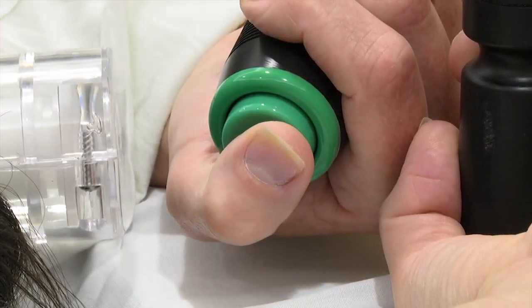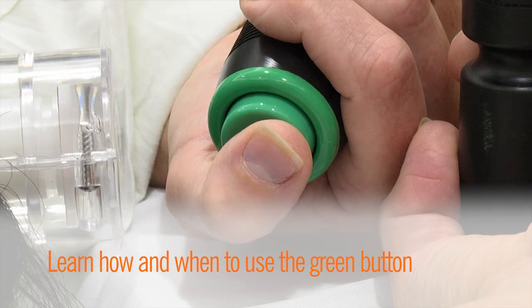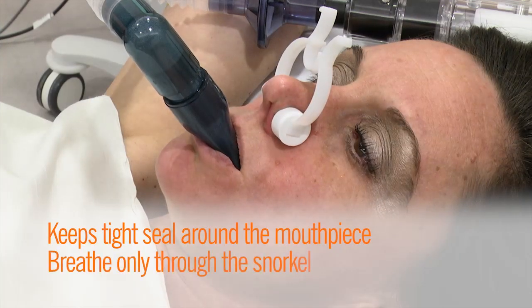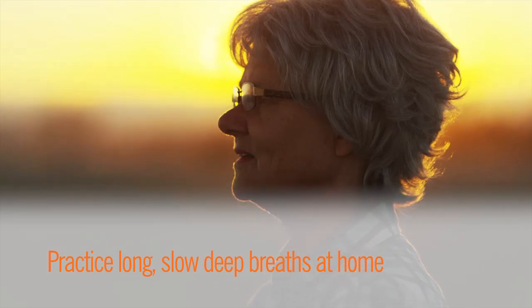Here are some important tips to remember. You will learn how and when to use the green button. Keep a tight seal around the mouthpiece and breathe only through the snorkel. You can practice taking long, slow, deep breaths at home before your treatment.